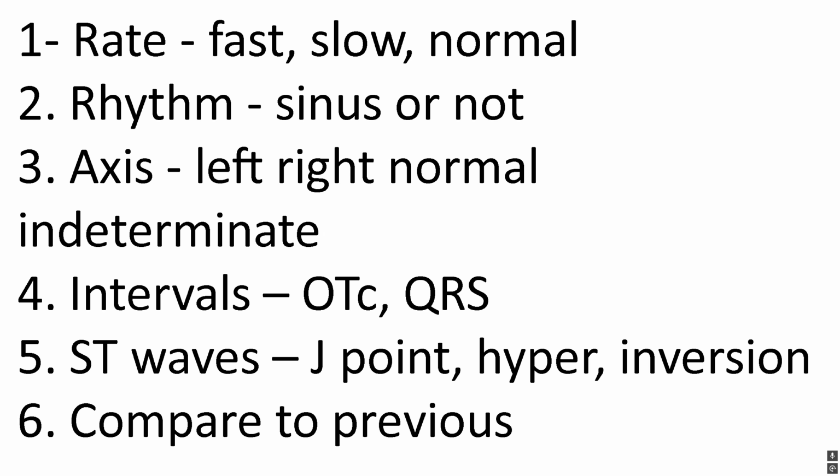The two things that helped me out: number one, to come up with a system. The system that I like just so happens to be all the things you need to bill for interpreting an EKG. Rate, rhythm, axis, intervals, ST waves, and then lastly, always compare to a previous.